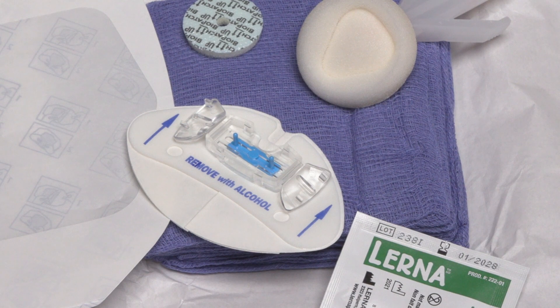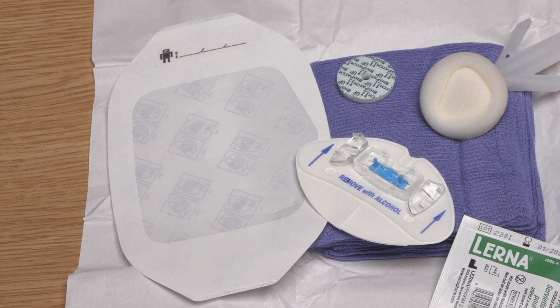As I am dressing a PICC I also need a securing device. This will secure the catheter in place underneath the transparent dressing and reduce the risk of the catheter migrating. I need a sterile, semi-permeable, transparent dressing. These dressings are waterproof and minimise moisture build-up, both of which contribute to reducing the risk of infection.